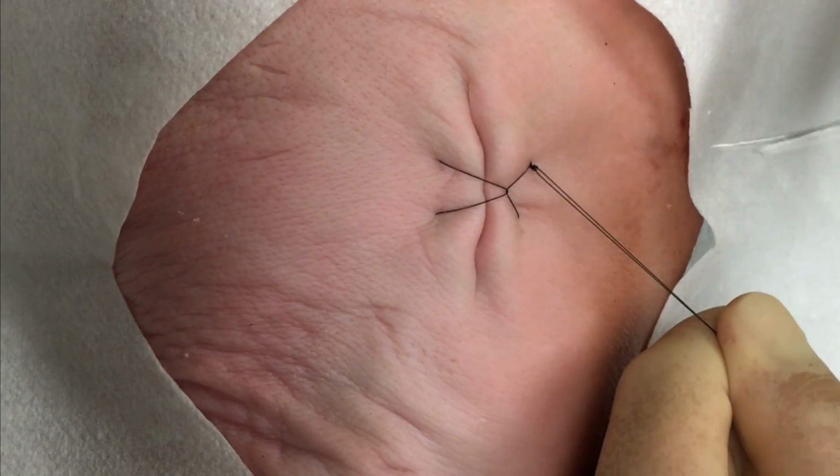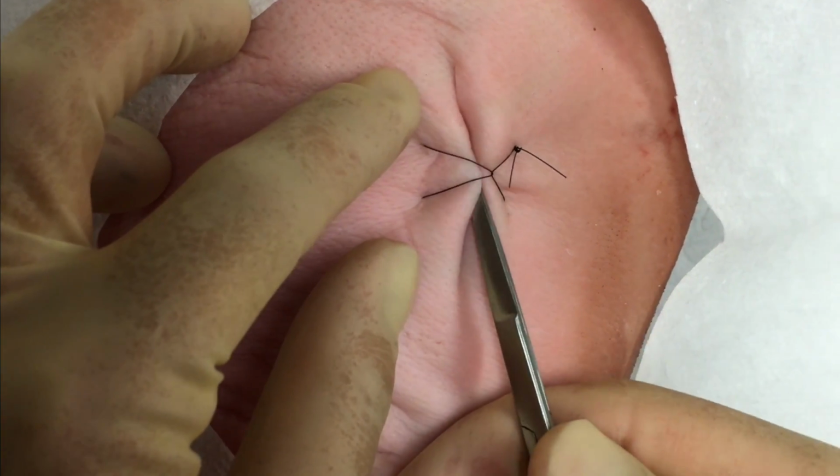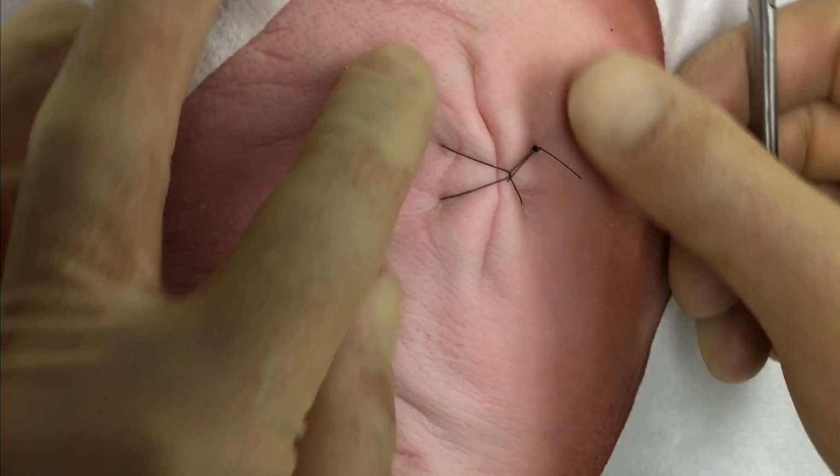The size and type of suture that you choose will depend on the area of the body. In this demonstration video, a 4/0 nylon suture is used, which is appropriate for closure on the extremities and the trunk.